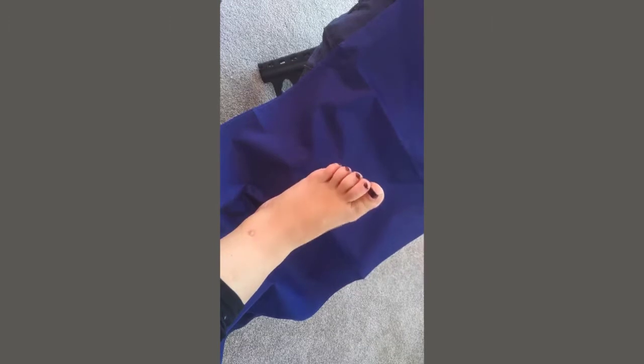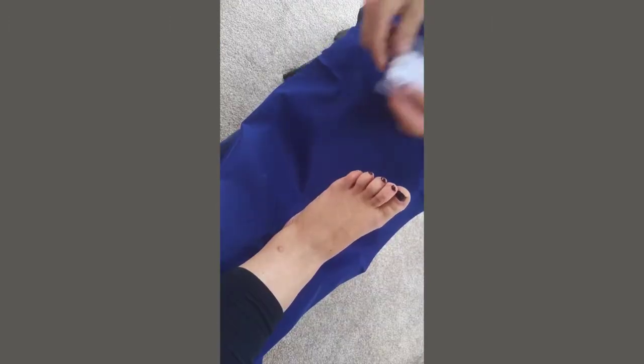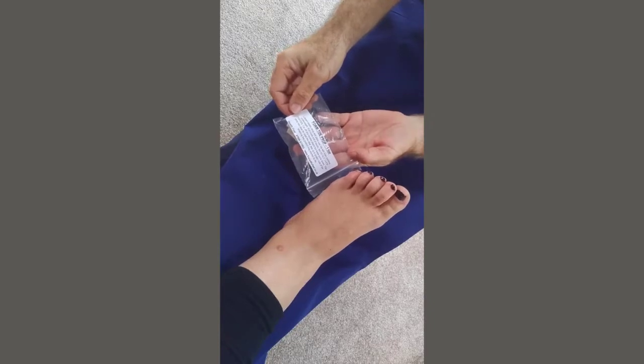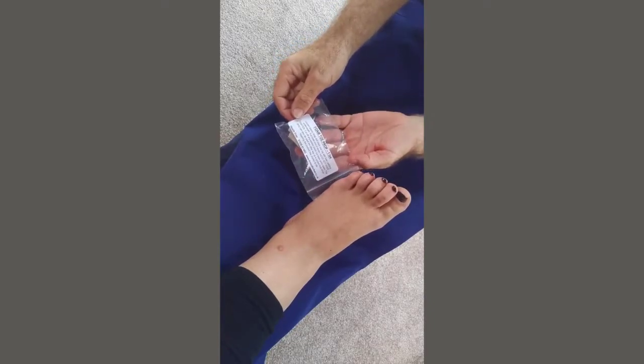Welcome to First Aid for Feet instructional video for the use of our foam toe props. This is our one-toe version. There are also versions for two toes and three toes.